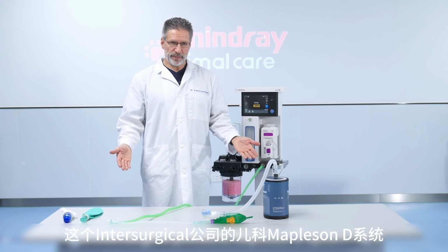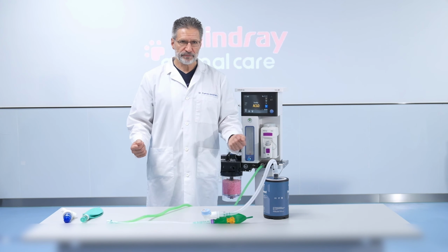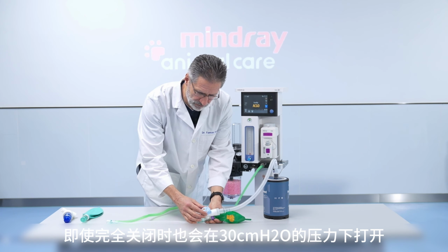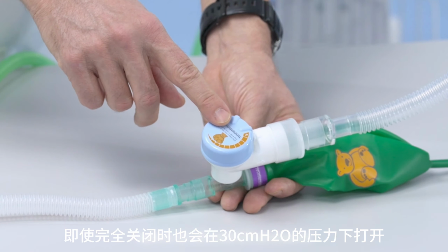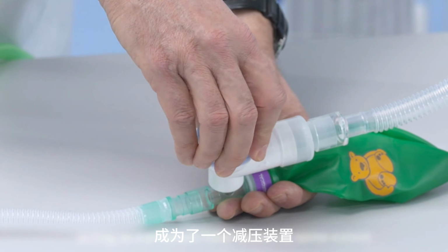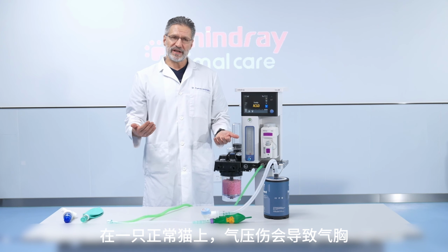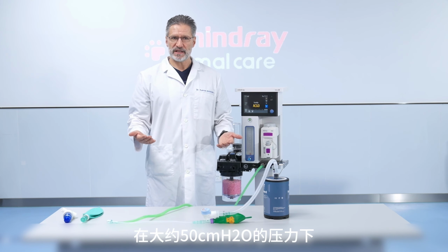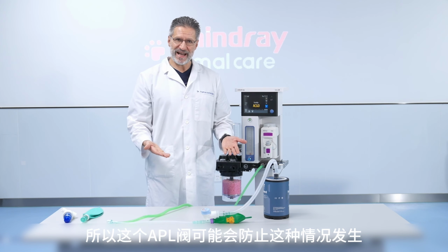This Intersurgical pediatric Mapleson D system here is set up and attached to the Beta 5. It has a very nice and intelligent APL valve which opens at 30 centimeters of water pressure even when it's completely closed. Hence, it's already acting as a pressure relief device to some extent, which is great. Barotrauma on an average cat will result in pneumothorax at about 50 centimeters of water pressure. So this APL valve will likely prevent that.